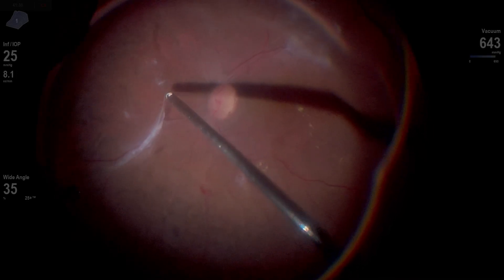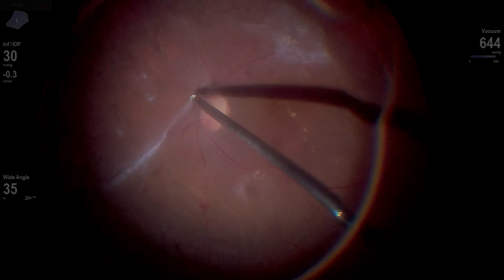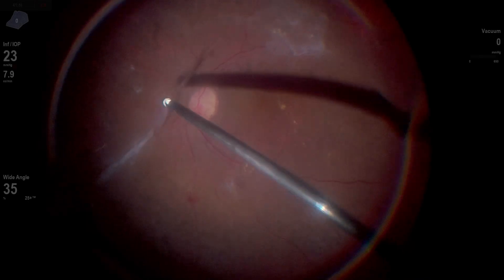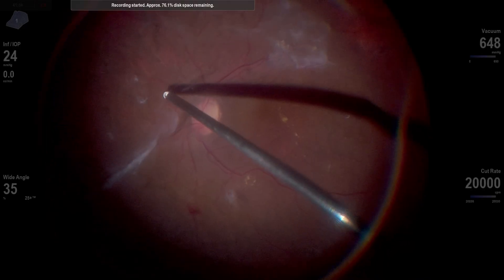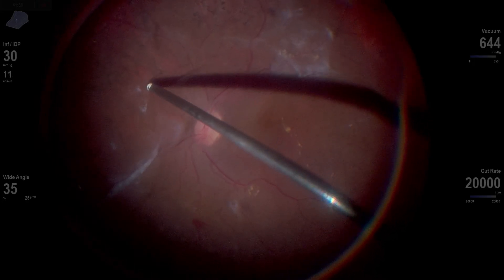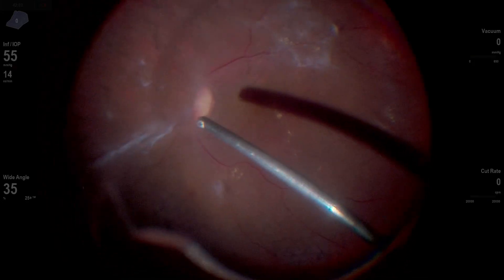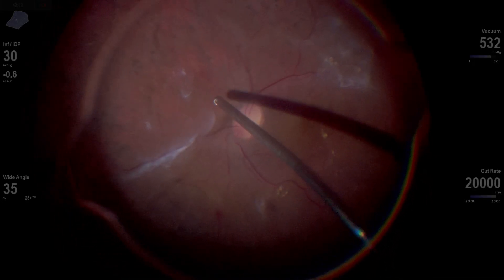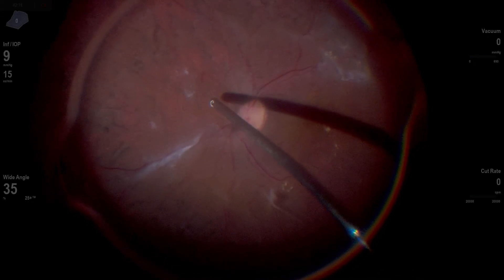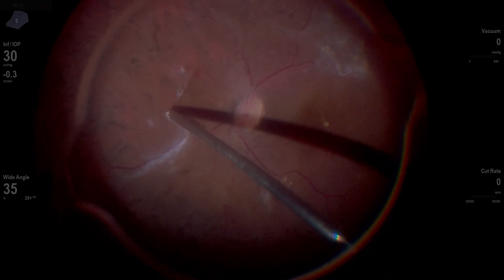Here I'm actually able to use this cutter like a pick again and like a forcep, and I'm starting to peel some of that fibrotic tissue off of the optic nerve. I'm watching the other tissue around it because I don't want to create any breaks — as I lift this, I'm seeing how the tissue responds. Once I get that vitreous up, I've got an area where I can actually segment. I created a nice segmentation trough nasally to separate that inferior plaque along the inferior temporal arcade and the more nasal traction.